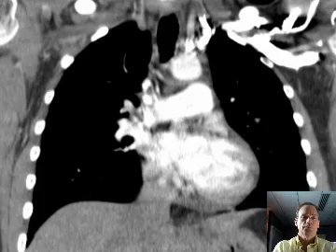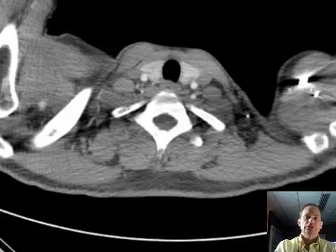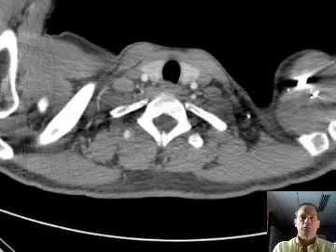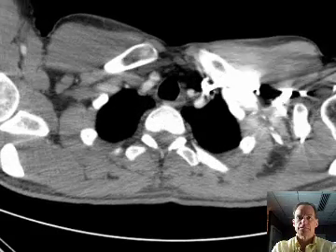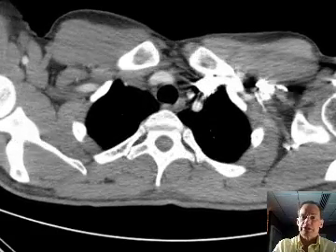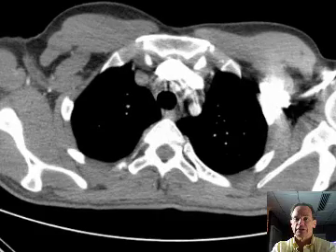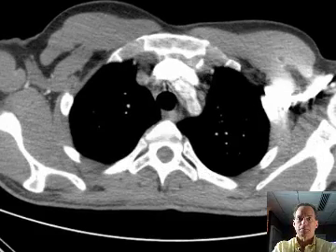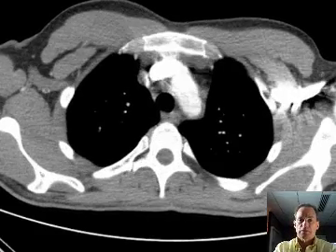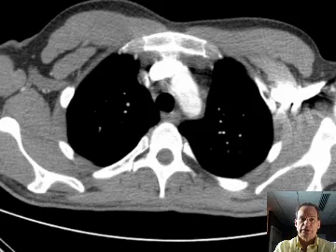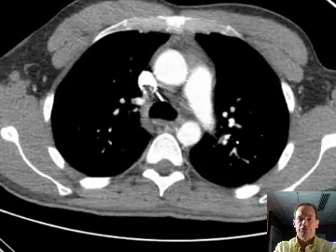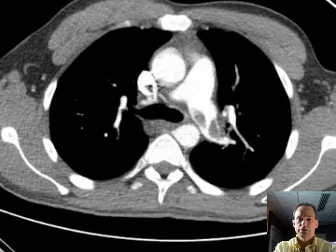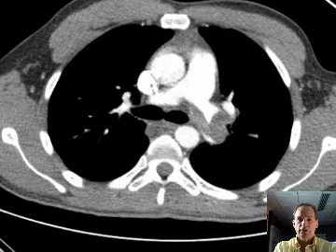We do CT pulmonary embolism protocol with these very thin slices to get a large number of slices and therefore fine detail. Here you can see we're still getting through the superior mediastinum, so let's move a little bit faster.